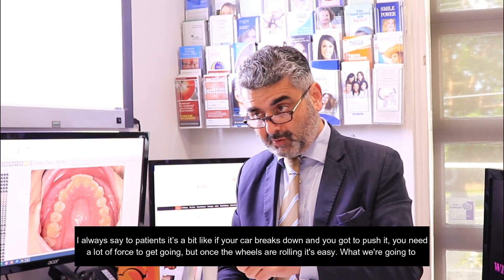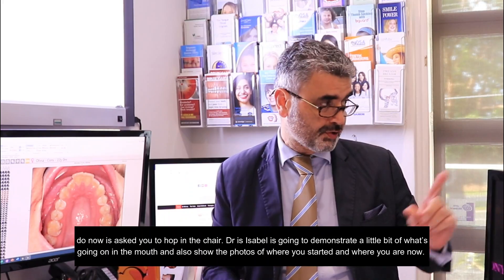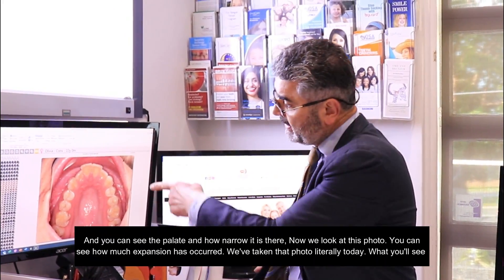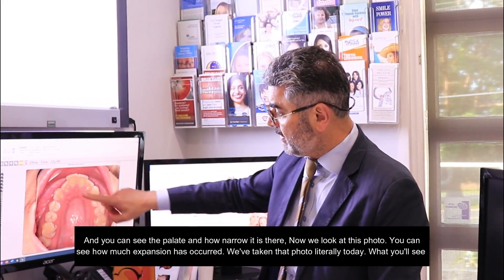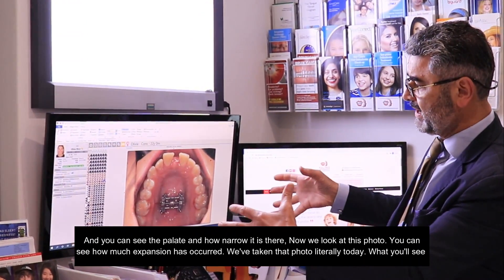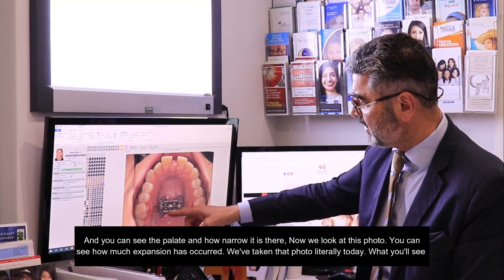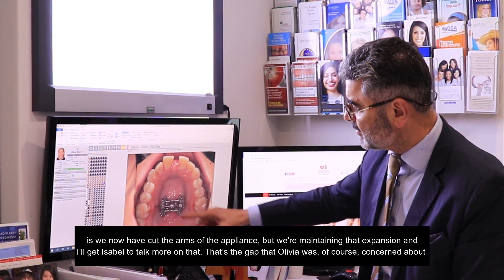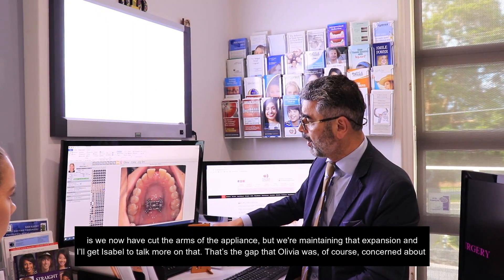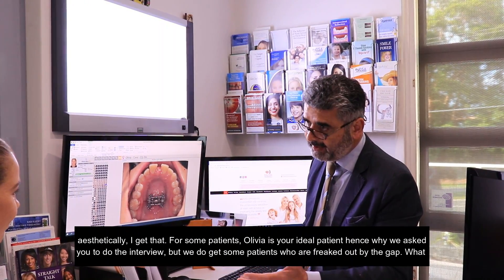So what we're going to do now is ask you to hop in the chair. Dr. Isabel is going to demonstrate a little bit in the mouth and also show the photos of where you started and where you are now. So that's where it is there — and if we look at this photo, you can see how much expansion has occurred. We've taken that photo literally today, so what you'll see is we've now cut the arms off the appliance but we're maintaining that expansion. That gap is what Olivia was concerned about aesthetically.